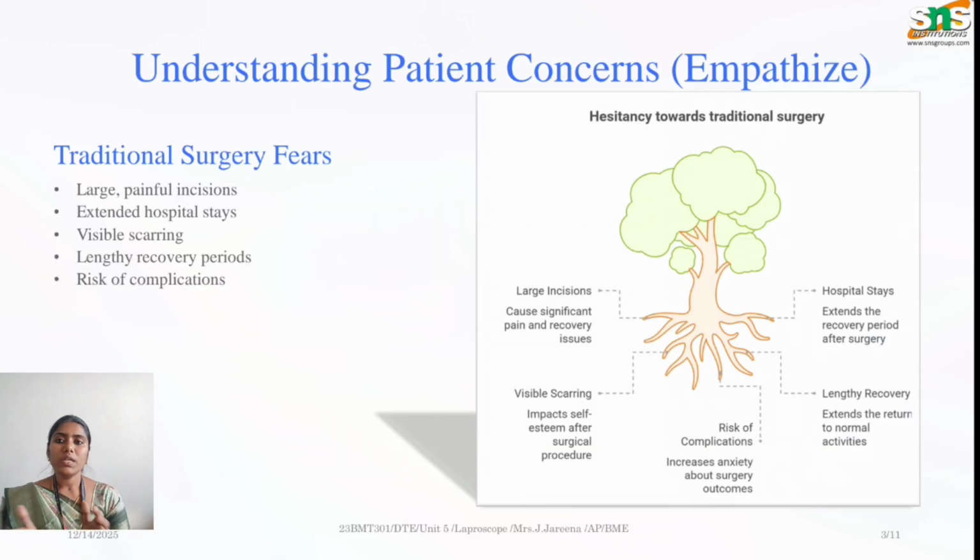The difference between laparoscope and endoscope is that the laparoscope is nothing but one kind of endoscope. Here we are making a small incision in order to navigate the equipment, that is a tool, inside the body in order to visualize the internal organs of the body. Whereas in the case of endoscope, we are sending the tool through a natural opening, it can be your mouth, your nose or your anus.